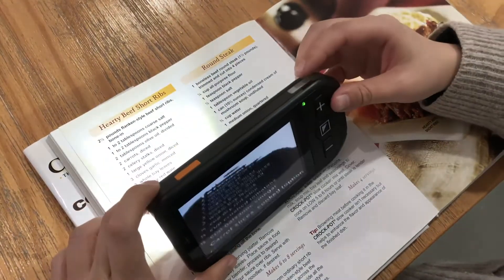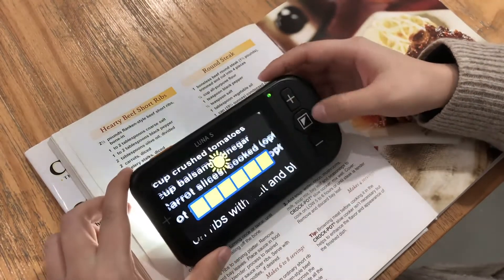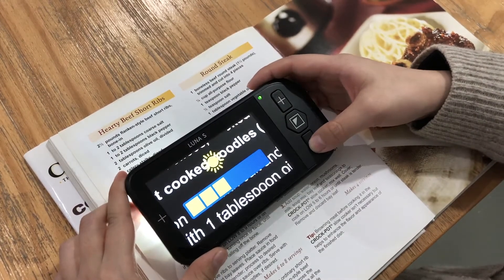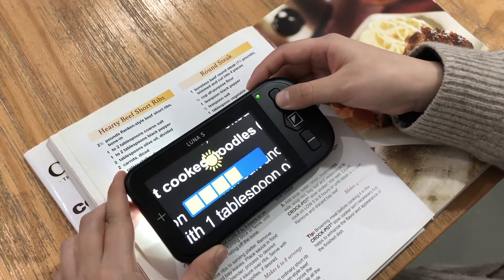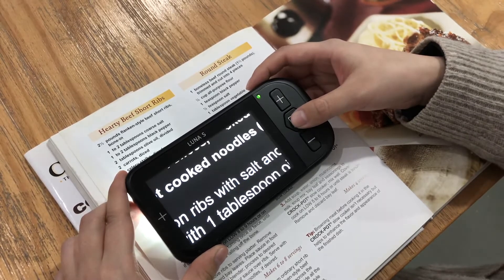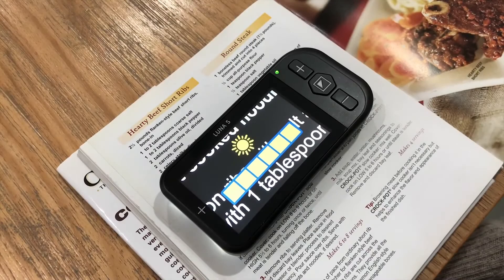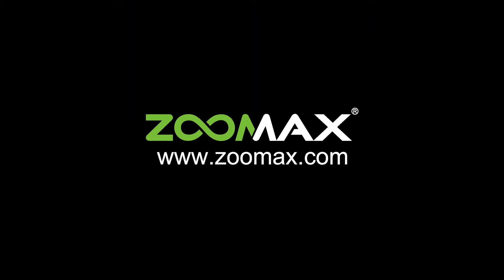Short press the freeze button and the zoom in or zoom out button simultaneously to enter screen brightness adjustment. Press the zoom in or zoom out button to increase or decrease the brightness. Press the mode button to confirm the brightness and exit, or leave it for 5 seconds until the brightness bar disappears.